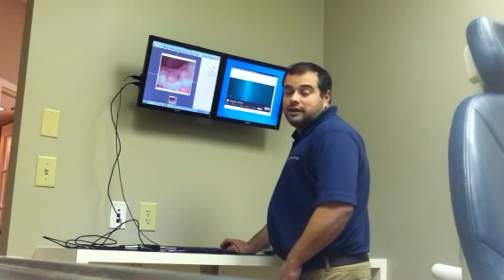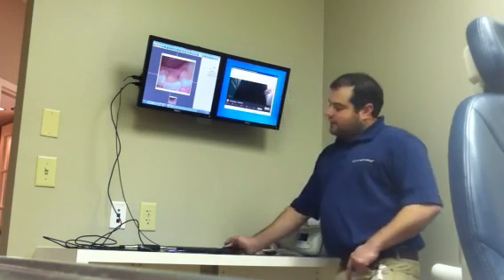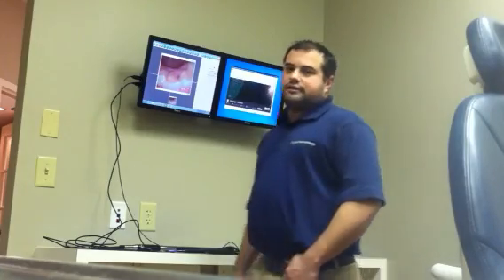And that's about it. Dual monitor display, Dentrix VDI in a box, Dentrix Dexis intraoral cameras, and X-ray sensors in the cloud.